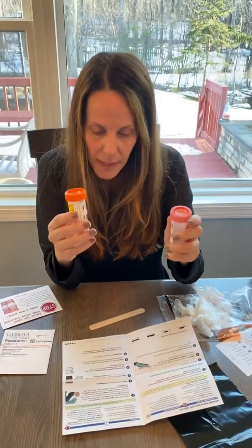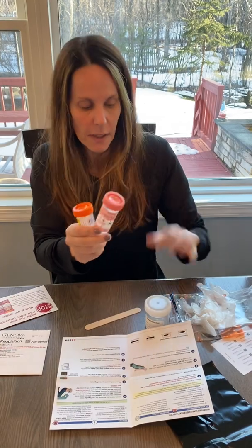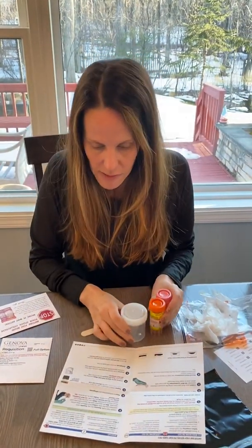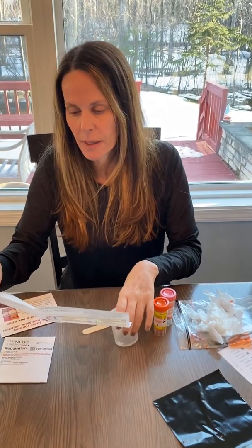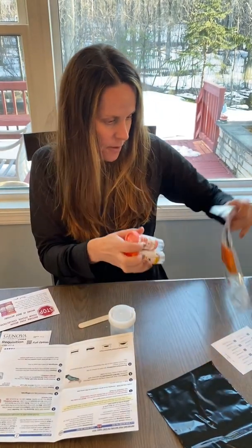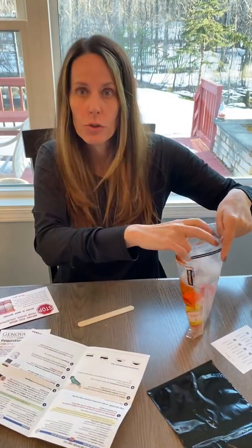Then you repeat the same thing with the orange top and the pink top and the white top. So you're going to put some of the poop in each one of these to the fill line. This one you just put a small amount, maybe it's like 30 on here, whatever you want. Shake it up, put it in here, you're all set. Then with the white top, this one, you're supposed to not exceed 40 ml. So like I said, the 30 ml is fine. Then you get rid of the rest of the poop, you flush it down the toilet, and then you refrigerate these all. These are going to go back in here, okay, and then keep them in the refrigerator. And you put this in here too, okay?